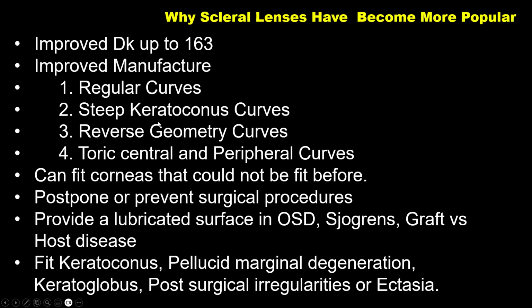So manufacturers of this scleral contact lens started thinking of how to improve on the qualities and manufacture different customized versions of the contact lens.